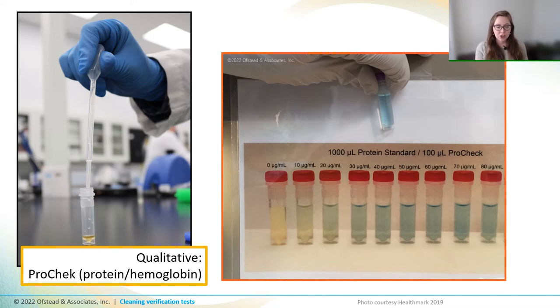And now if you look at this color chart, it's pretty easy to distinguish between the negative, which is that yellow arrow on the left, yellow green, greenish blue, and finally blue at that 30 micrograms per milliliter or more. But above that, the blues all tend to look the same to us.